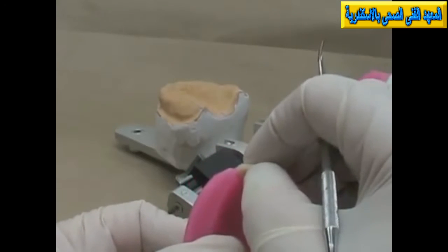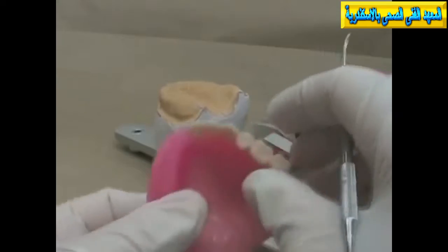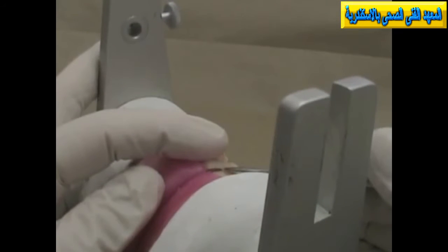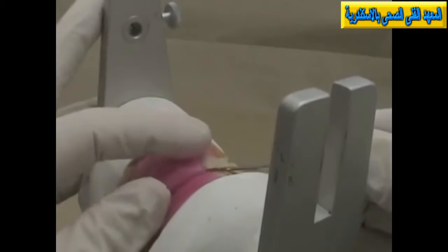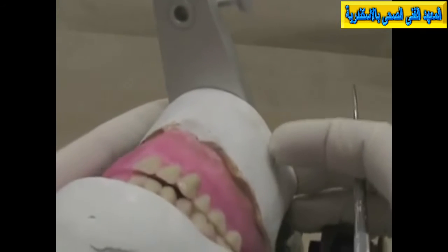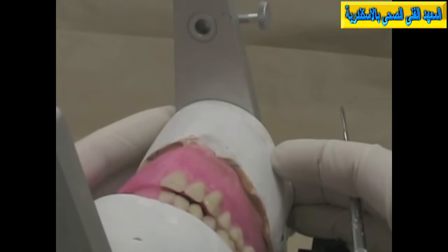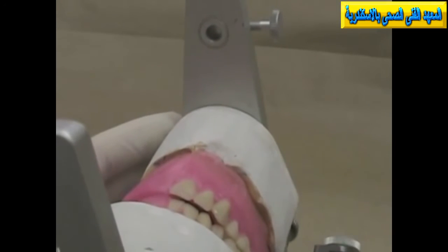Now I'm going to just use a little pressure. I'm going to move the tooth out there a little bit, put it back on my rim, check it against the rest of the teeth here, and I'm looking to make sure that my overjet is even between my central incisors and my lateral incisors, and that's looking a little bit more even to me now. We'll proceed then to start setting the maxillary anterior teeth on the opposite side.